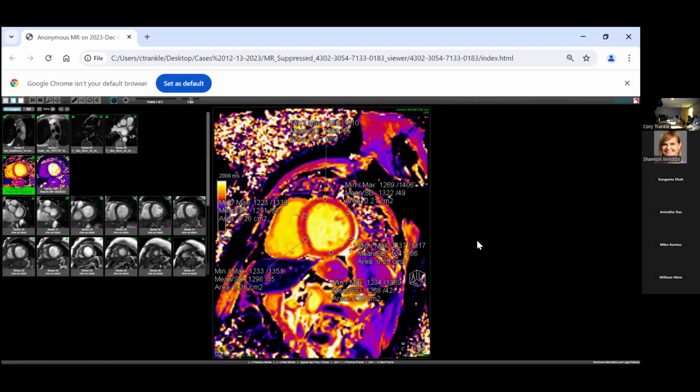This is a color image. It's an in-color image, so that's the one we're looking at. You can see all these moving things on the left. We're going to talk about how we make the movies next week. We're going to talk about these still images. And what I want you to notice, the image is made of, we call it in two dimensions, pixels. See if you can see, you can't see my pen. If you look at the top left part of the color image, you're going to see fuzziness, but there are lots of little squares.